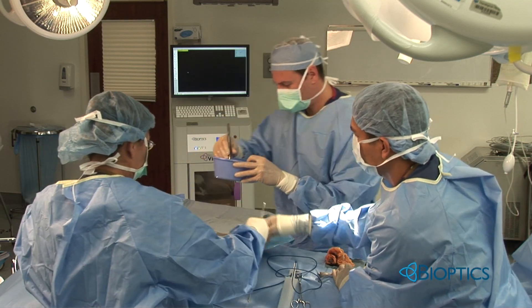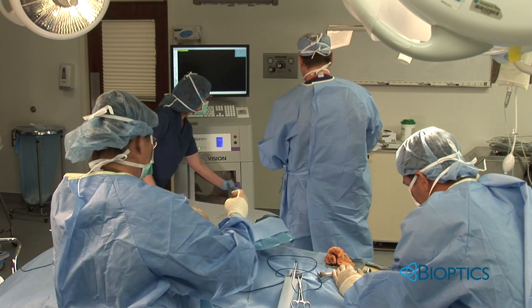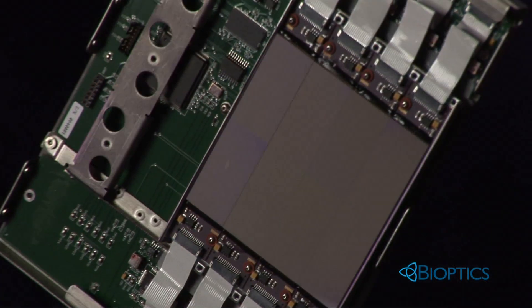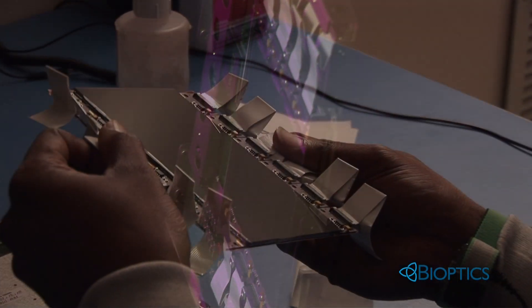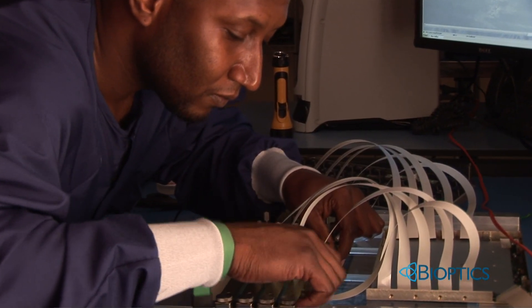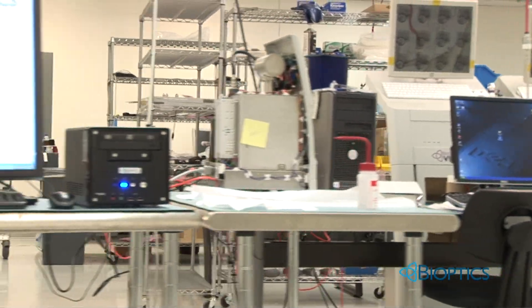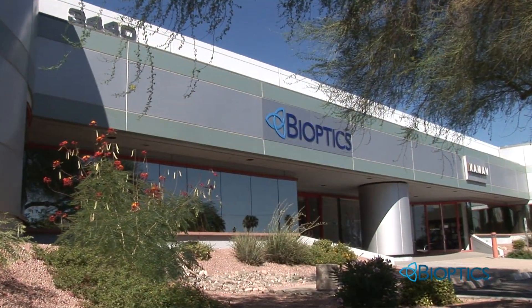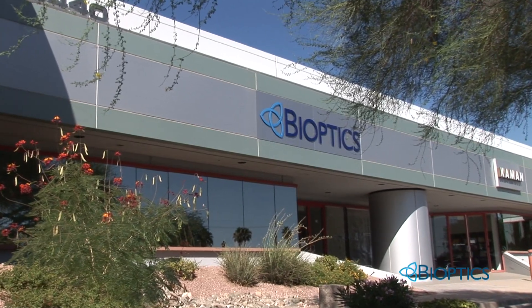Why is the Bioptics BioVision so popular among surgical facilities throughout the country? One of the reasons is that we are the only specimen imaging company that manufactures its own detector — the key component of the system — and we designed it to achieve the highest image quality. It is all made to the highest standards in our high-tech factory in Tucson, Arizona, and we proudly stand behind every unit we manufacture.